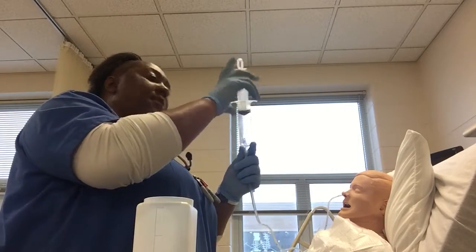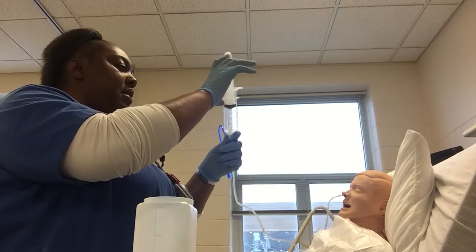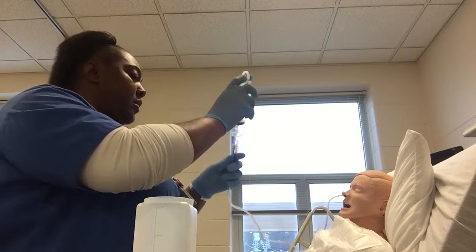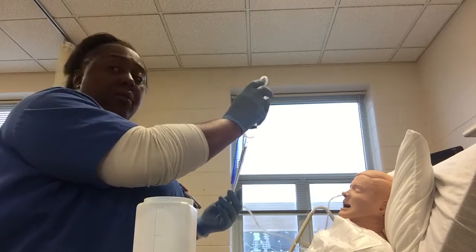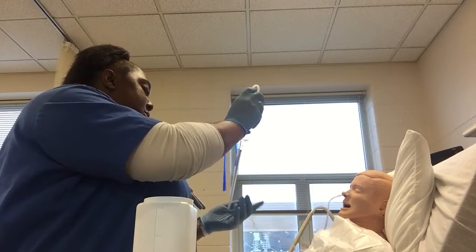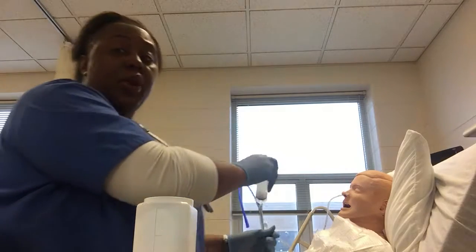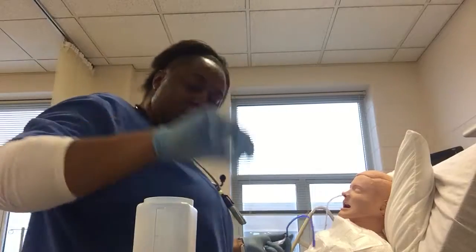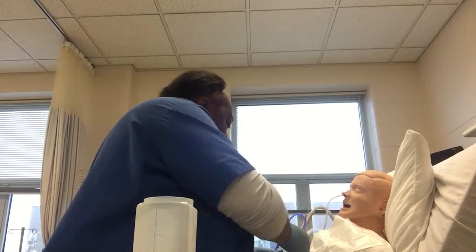And then I can either let gravity slowly pull it down, or I can intermittently push the water down myself to ensure that the line is clear. I'll put 60 milliliters of water in there to make sure that all the 50 goes down. And then once it gets down to 10 milliliters left, I will ensure that I close it off, so that way no air goes into the patient. And then I will disconnect, and then I will hook that back in there.